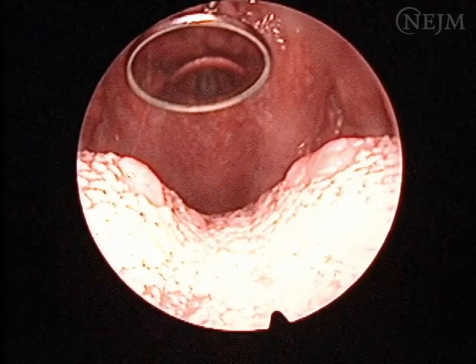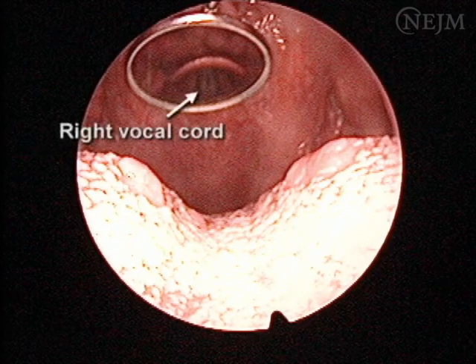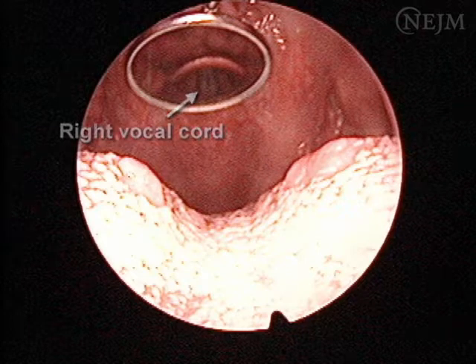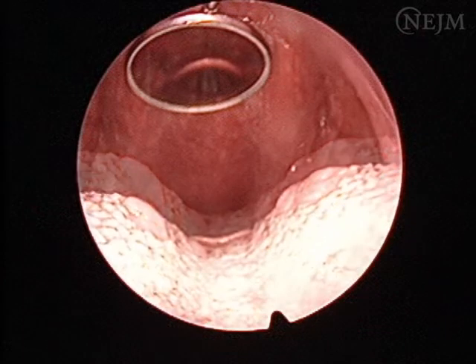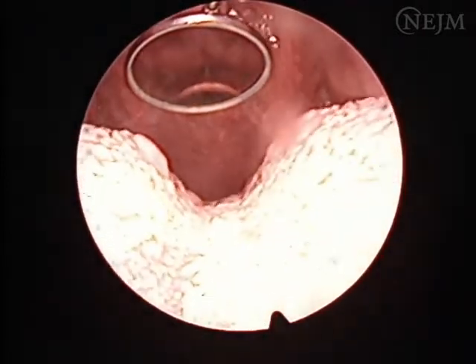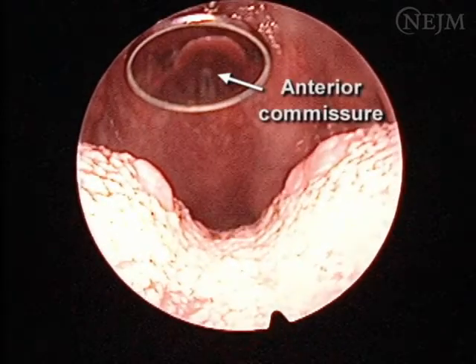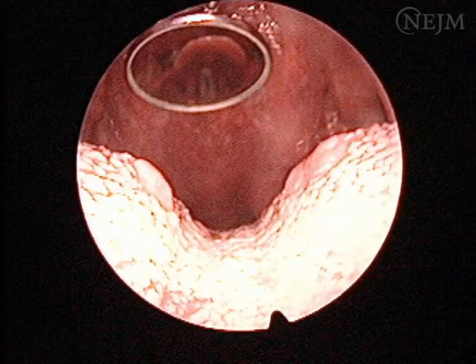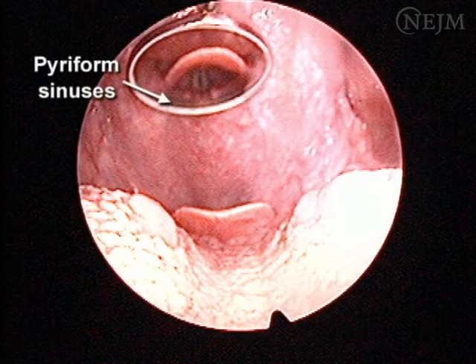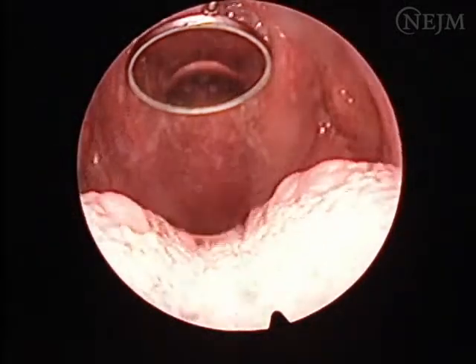"E." With mirror laryngoscopy, the image is inverted. In other words, the right vocal cord appears on the left side of the examiner's view on the mirror, and vice versa. The anterior aspect of the larynx can be seen by asking the patient to say "E" in an even higher register. This fully visualizes the anterior commissure. The oropharyngeal vallecula and the piriform sinuses in the hypopharynx are also visualized and should be inspected for symmetry.